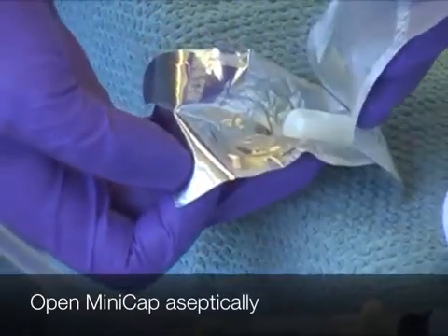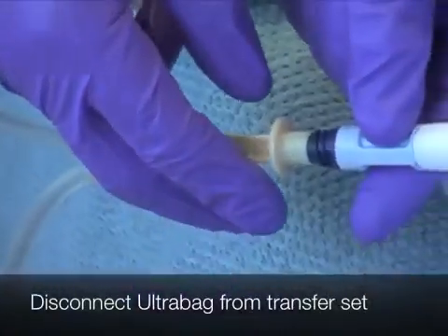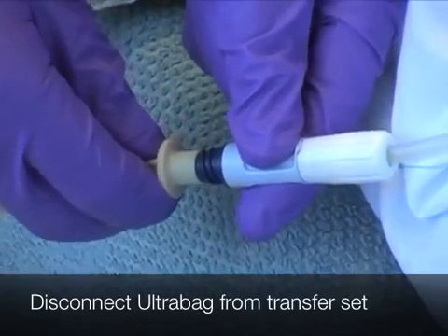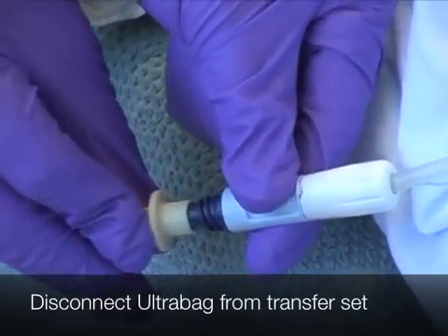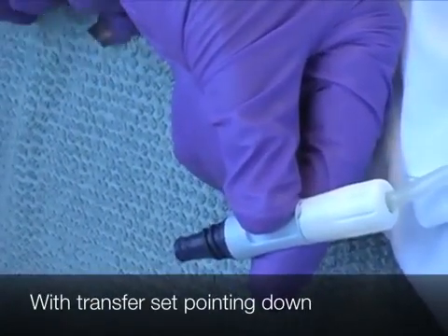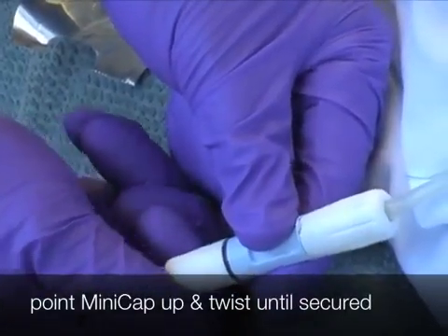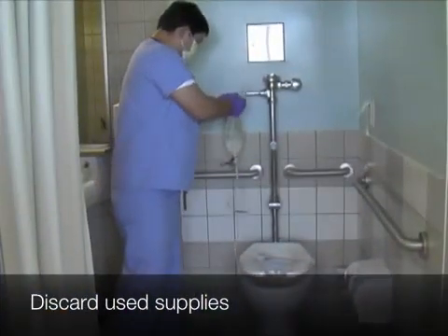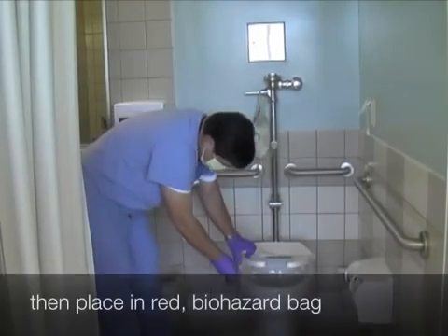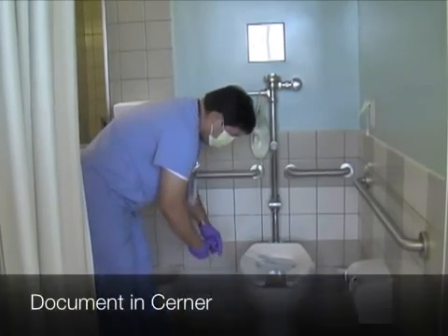Open the mini cap aseptically. Disconnect the ultra bag from the transfer set. With the transfer set pointing down, point the mini cap up and twist until secured. Discard the used supplies. Empty the drain bag in the toilet, then place it in the red biohazard bag. Document in Cerner.